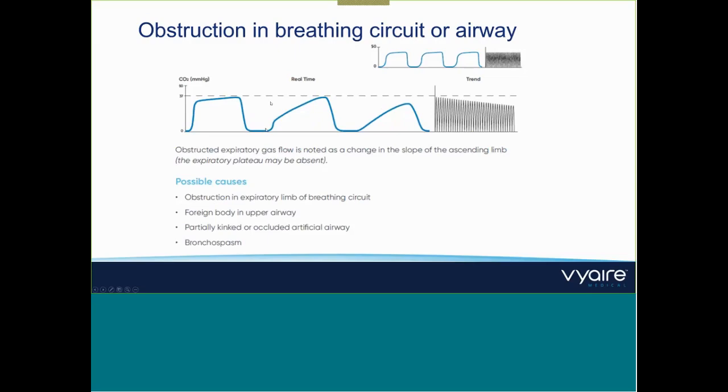So the fast emptying alveoli, something's not working correctly here. Could also be something kinked on the expiratory side from the ventilator, but very often and mainly these are reasons from the patient who might have some obstructive problems. So the next one.